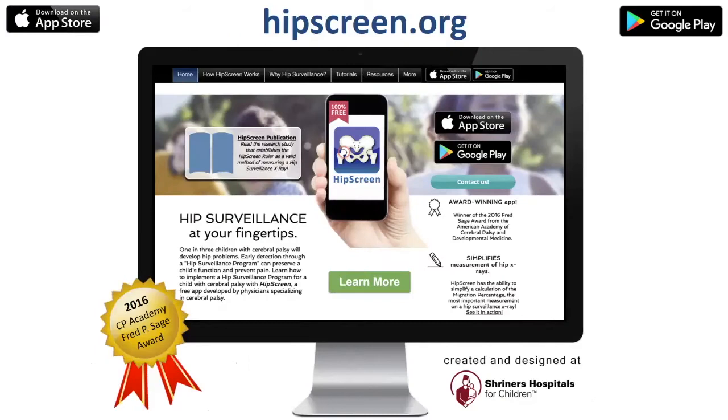Before we get started, it's really helpful to look at the HipScreen.org website, and particularly the tutorial section, because much of what I'm presenting today is available on that tutorial section as videos and other resources. The HipScreen app can be downloaded for free without any commercial content. And the HipScreen app doesn't transmit any of your data to any outside server. It's purely a community-based effort to try to increase the availability of hip surveillance to all children with cerebral palsy.